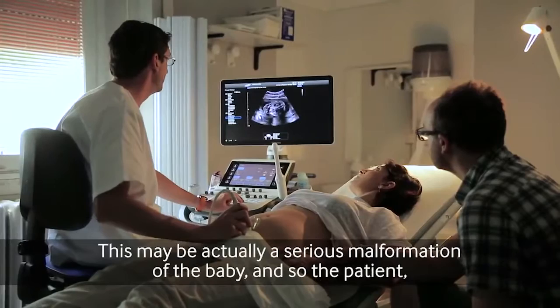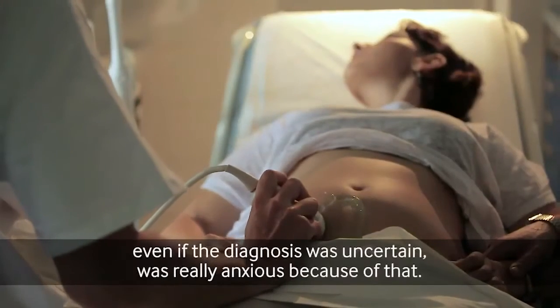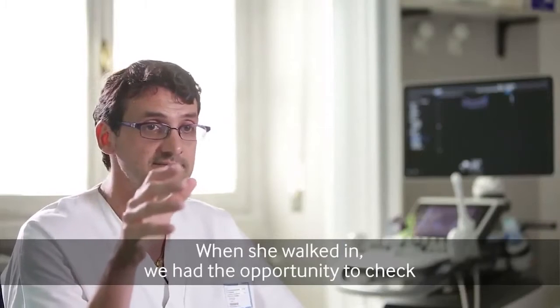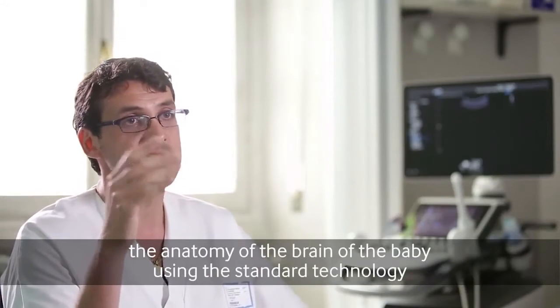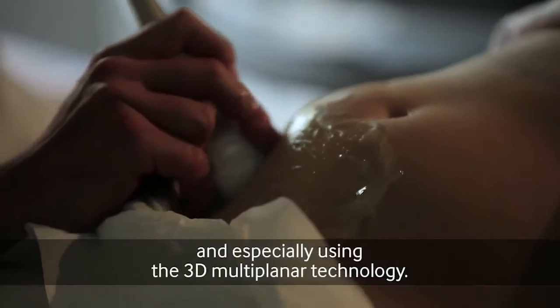This may actually be a serious malformation of the baby, and so the patient, even if the diagnosis was uncertain, was really anxious because of that. When she walked in, we had the opportunity to check the anatomy of the brain of the baby using the standard technology and especially using the 3D multiplanar technology.